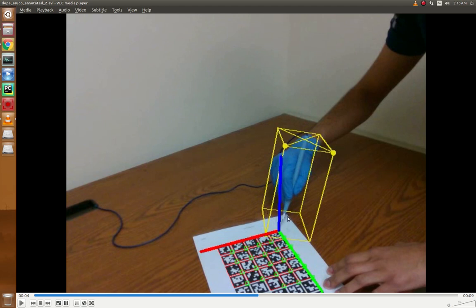Using DOPE, I will find the pose and get all the 8 points. From there, I can calculate the location of the center point of the bottom plane, and that is my guess of the position of the tip.